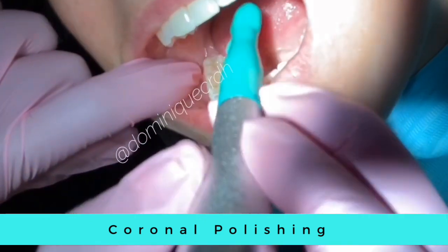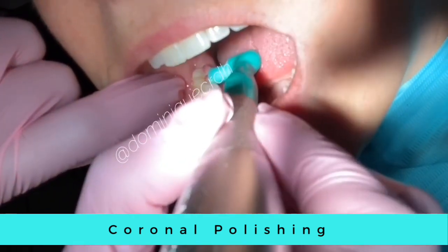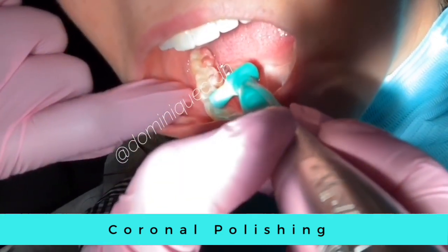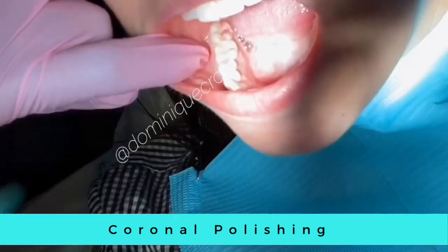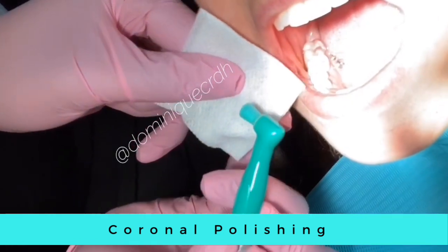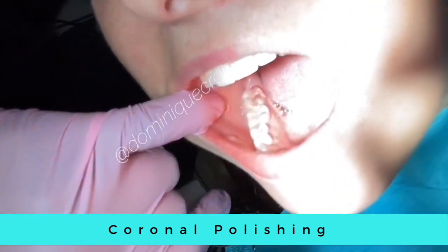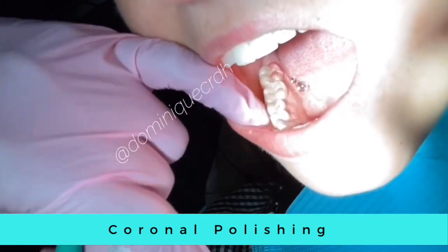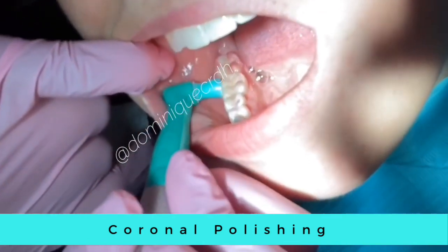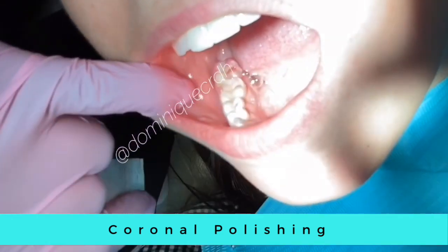Have the patient bite down just slightly so you can reach those back molars, and take the polishing cup right around the margins of the gingiva to clean the patient's teeth, making sure you have a fulcrum the whole time. You can use a gauze and just touch the rheostat to clean out the profi cup if there is excess saliva. Reload and continue going right around the gingival margin of the tooth.